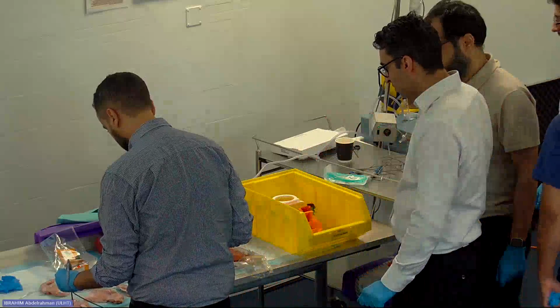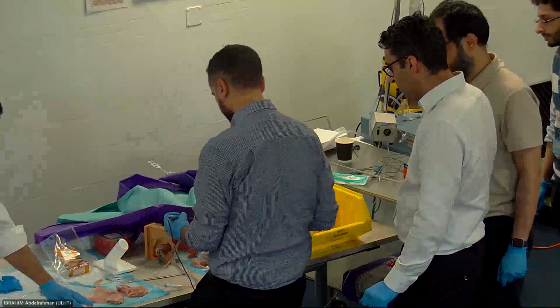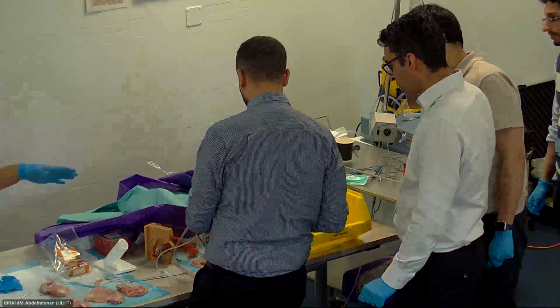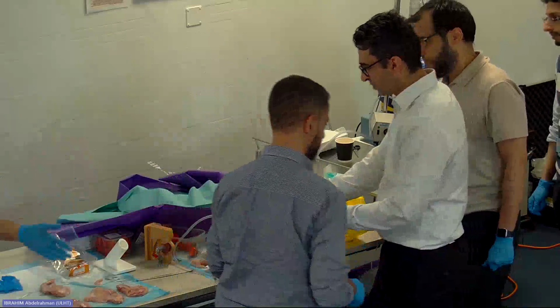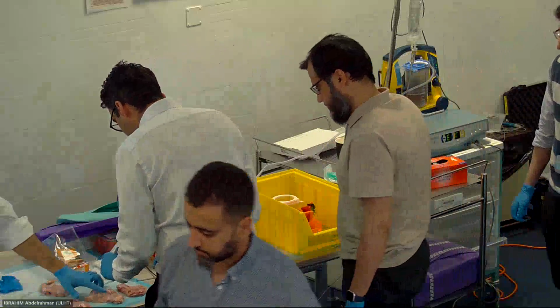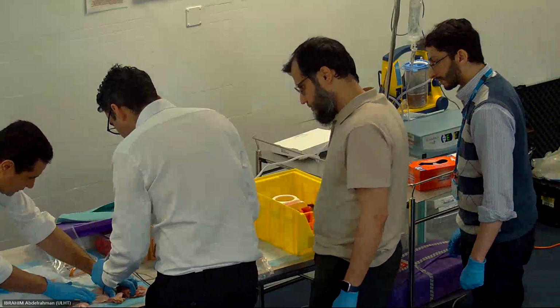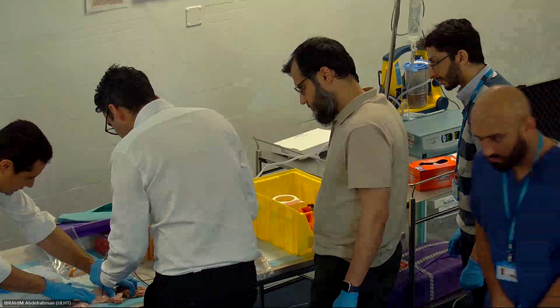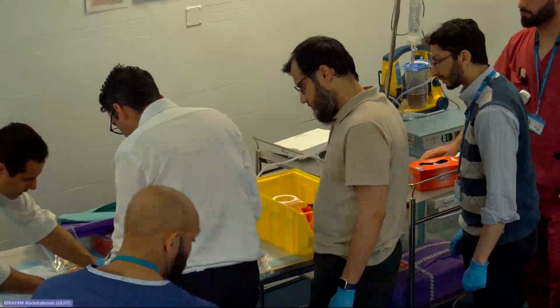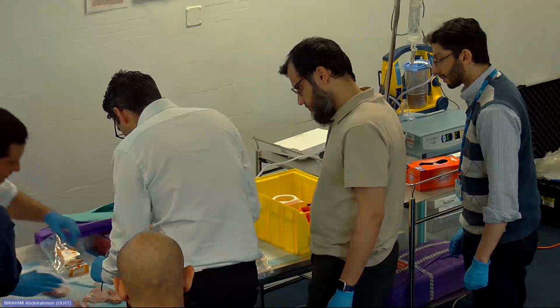But it's very slow. Anyway, we're gonna do it on the tonsils, okay, so do like half of the tonsil, so we're gonna overrun it, so don't worry. Faster so you can get a time and like go in and go out so you can suction it out.